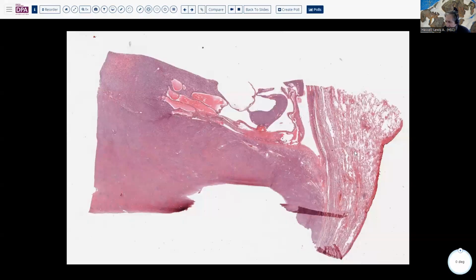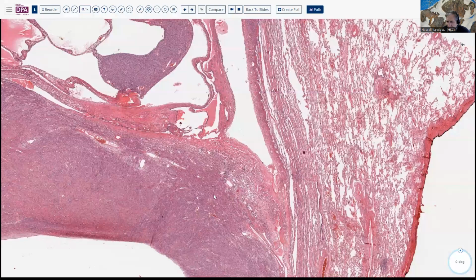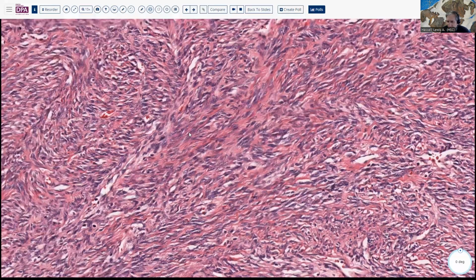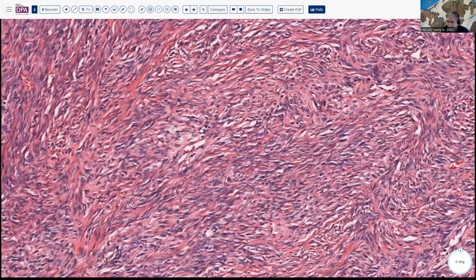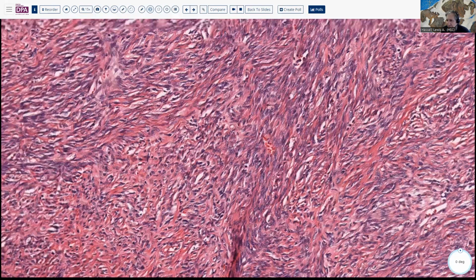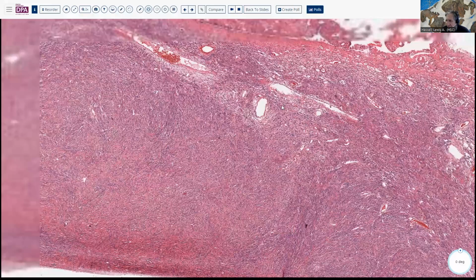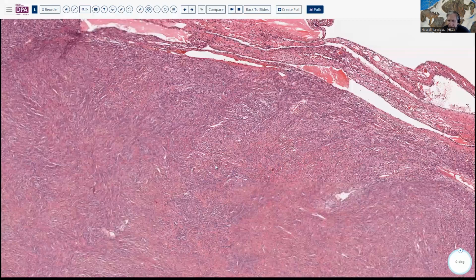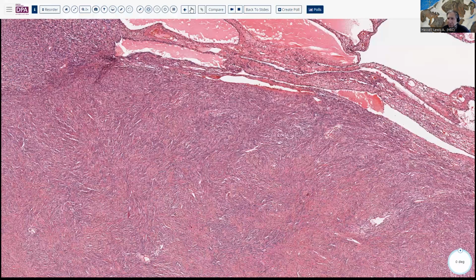And here's another example. This is occurring in the lung, as you can see here. Fairly uniform, not particularly worrisome for malignancy in this case. I don't see mitotic figures. So even though it's obviously involving the lung, resection of this lesion should result in a good outcome. And you can see these, again, very dilated ectatic vascular type spaces throughout this lesion in this patternless pattern background.